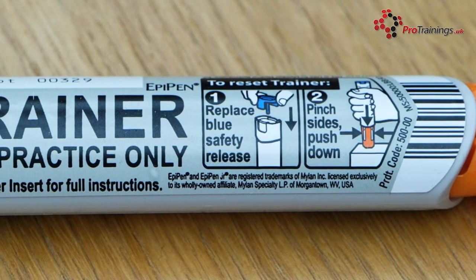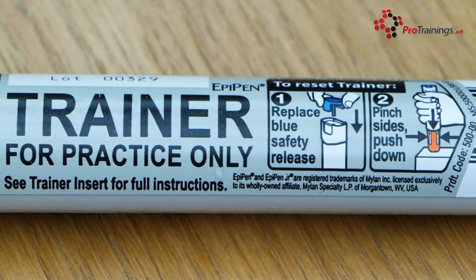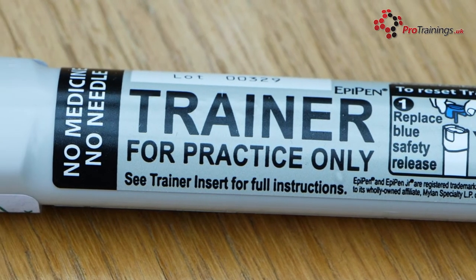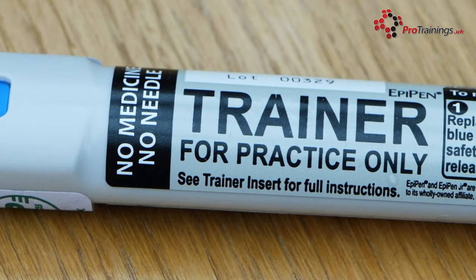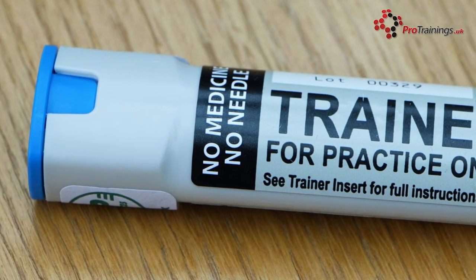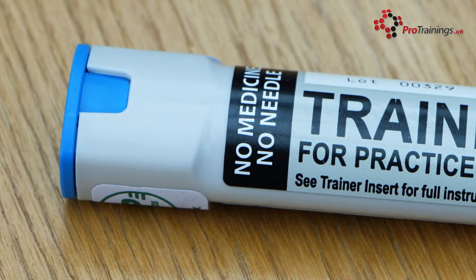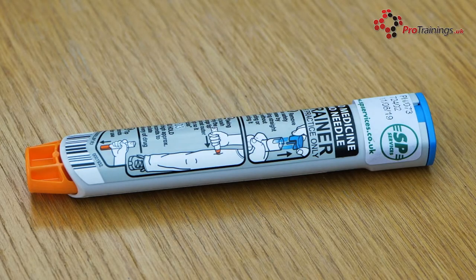To avoid accidents and to prevent damage to the EpiPen, it should always be kept in its case when not in use. There are easy-to-read instructions down the side of each pen, and these should be consulted every time one is used, even if you have used them before, to remind you of exactly what to do and to ensure that there haven't been any changes in regulations or use.